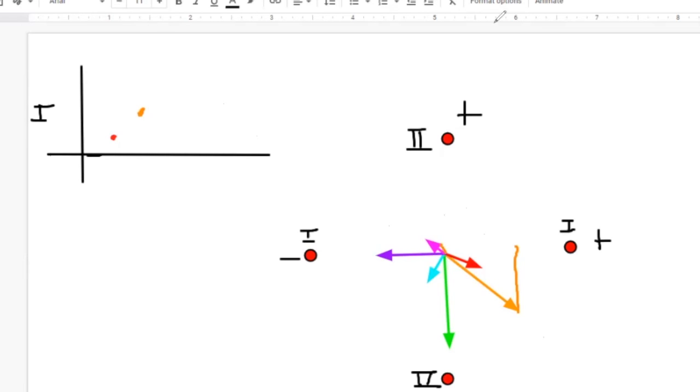And then what about the green one? Eric, what is the magnitude going to be on the green? Roughly 0, maybe a little positive, but pretty low here. Ben, what's it going to be for the cyan vector? Also, I'm sorry if anyone's colorblind, I tried. It's going to be a small negative. Anna, what's it going to be for the purple vector on lead 1? More negative.